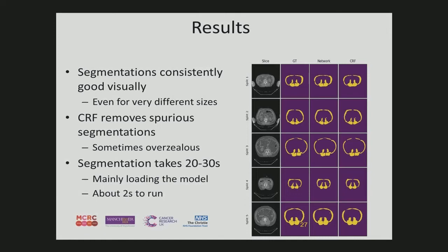And the result is a fairly nice segmentation result, with like a 95% success rate. It's not 100% there, but it's good. And it's very fast, although we need to do a little bit of work because we are only doing a single slice, kind of for standardization. And what that slice is, we still need to write a network to find that slice. We've now done that manually, which is like 5 seconds work per patient. But still, that's a bit of a thing.